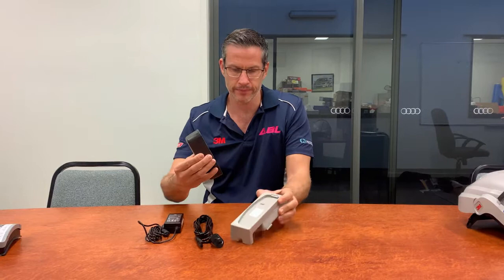Next we'll show you how to connect your Versaflow battery for charging with its docking station. The battery, the docking station, and your connection points. Simply take the battery, slot it back in like so, connect your leads, and insert into the docking station, then into a power point.